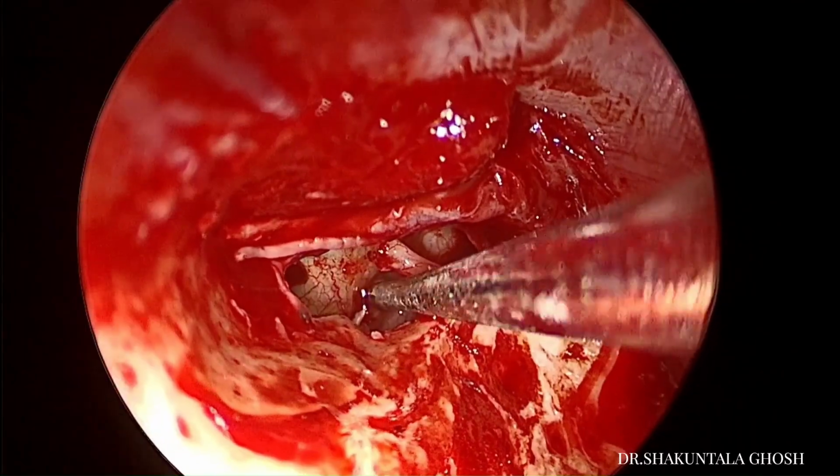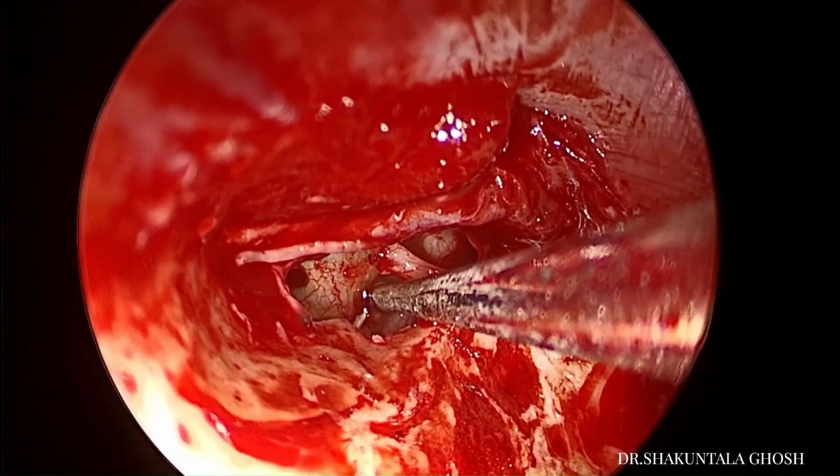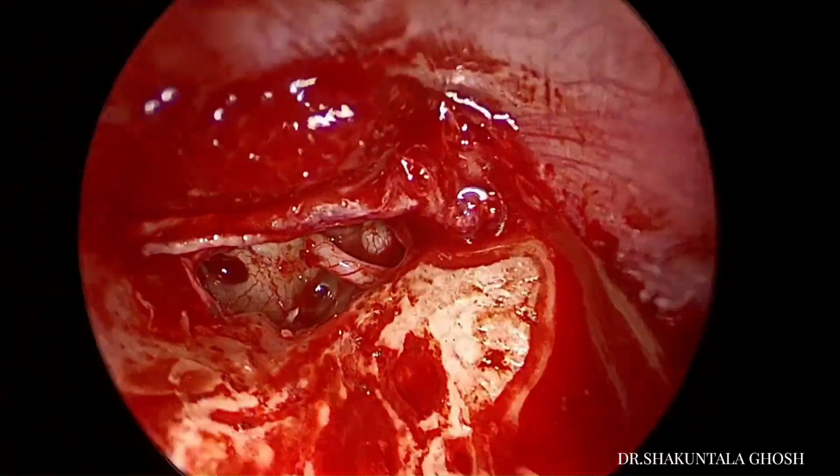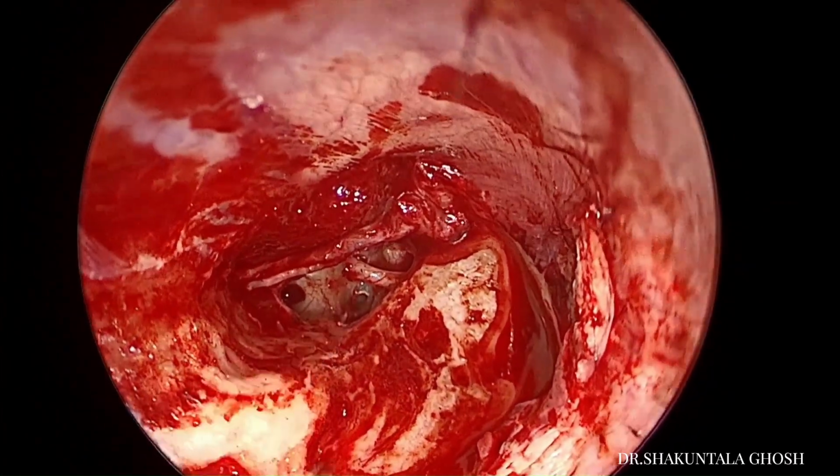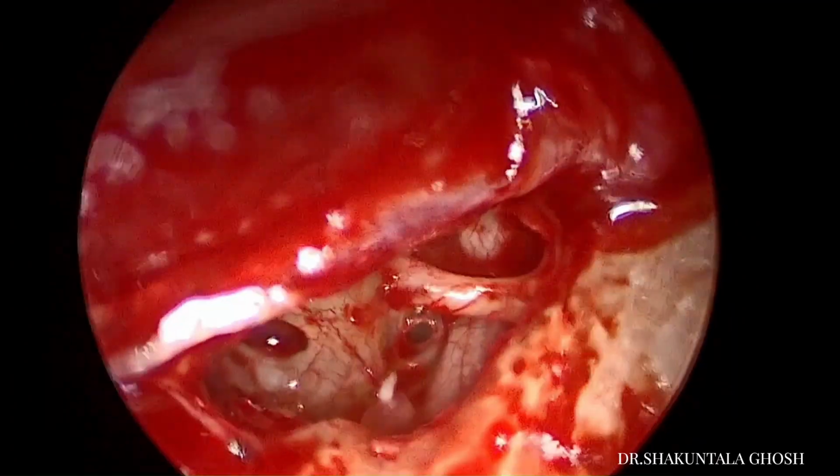So with gentle rotatory movements, I am trying to make a fenestrum of 0.5 mm diameter in the posterior part of the foot plate. Once I have done that and I have felt a give, the patient also complains of mild vertigo, and you can see that I have made a fenestrum here.